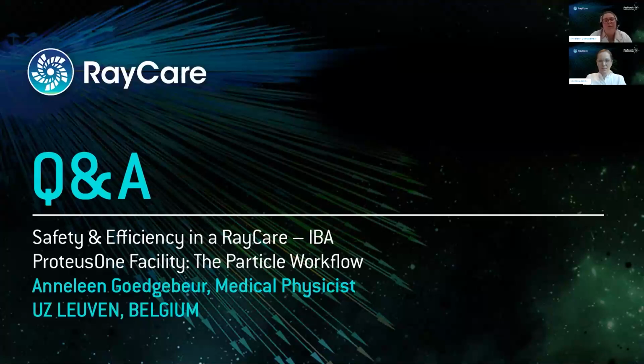We did have a couple of issues with individual patients, where the link between the RayCare patient and the RayStation plan was lost due to a chain of data addition within the patient flags and some subsequent synchronization issues. Quite luckily, the severe patient where this irreversibly arose was our morning QA patient. So we're lucky on that side, I would say. And actually, this specific broken patient issue should be fixed when we upgrade as well. Also worth noting that when this happens, we just log a case on the RayStation side and get the needed support and further investigation from RaySearch, as you would expect.